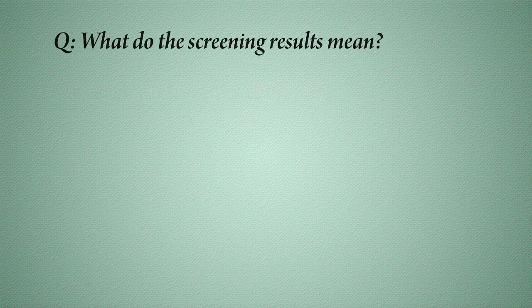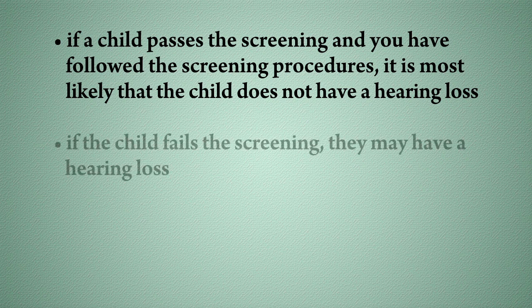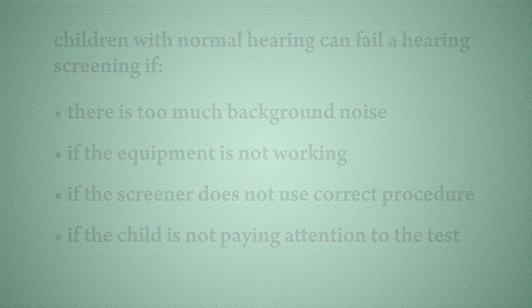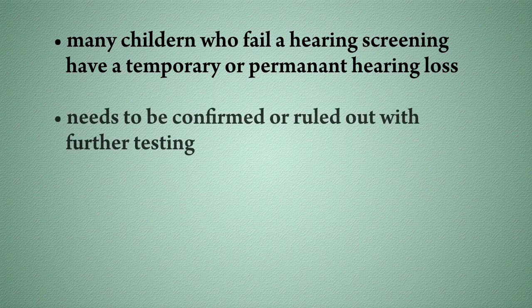What do the screening results mean? If the child passes the screening and you have done a good job of following the screening procedures, it is most likely that the child does not currently have a hearing loss. If the child fails the screening, they may have a hearing loss, but keep in mind the screening does not diagnose a hearing loss. Children with normal hearing can fail a hearing screening if there is too much background noise, if the equipment is not working, if the screener does not use correct procedure, or if the child is not paying attention to the test. Many children who fail a hearing screening have a temporary or permanent hearing loss, which needs to be confirmed or ruled out with further audiological testing.